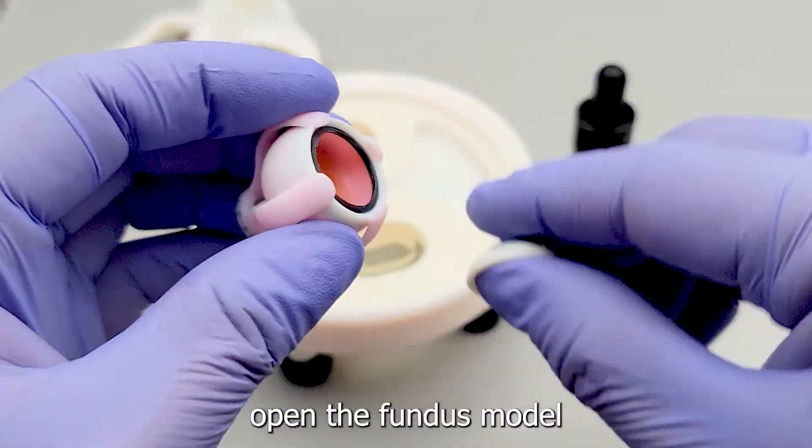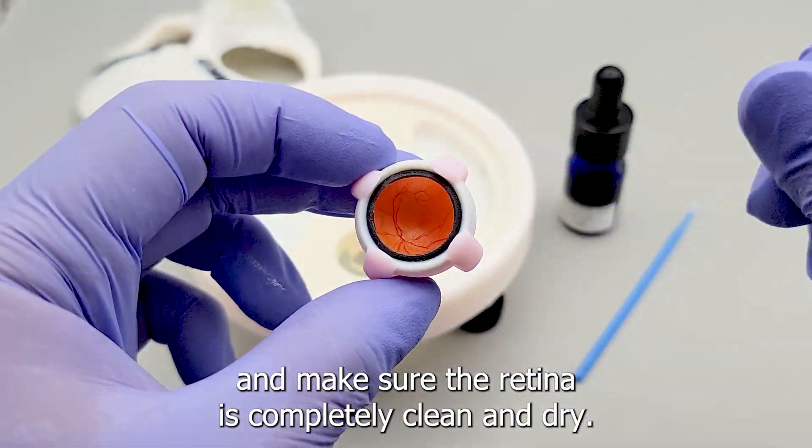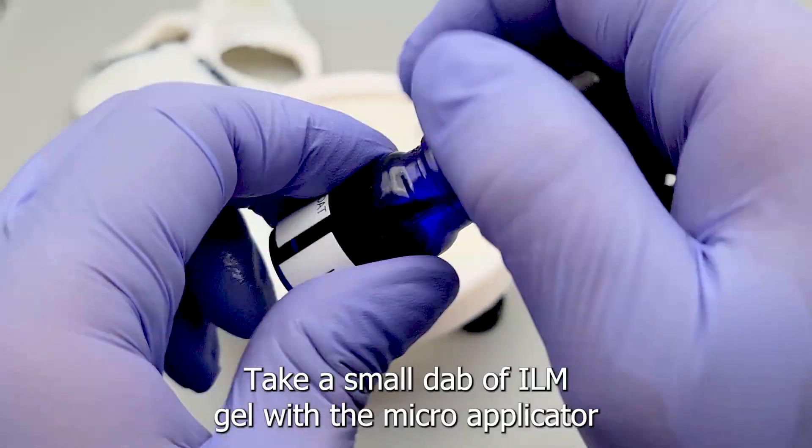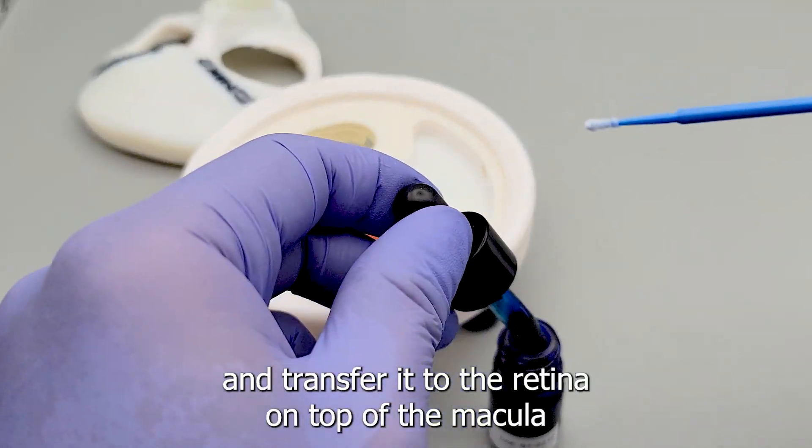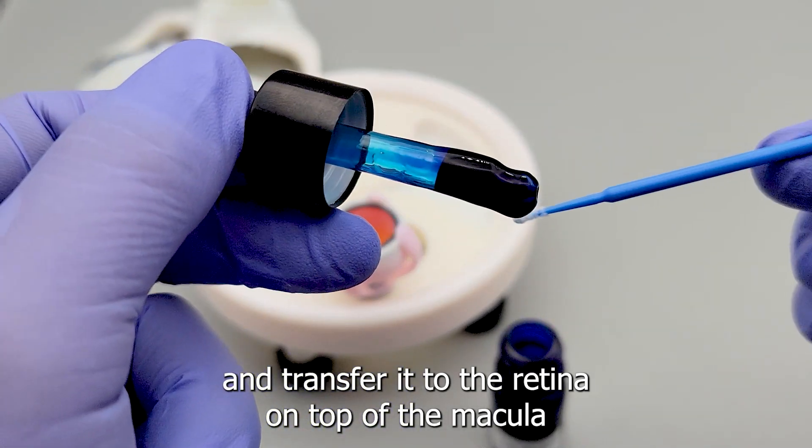Open the fundus model and make sure the retina is completely clean and dry. Take a small dab of ILM gel with the micro applicator and transfer it to the retina on top of the macula.